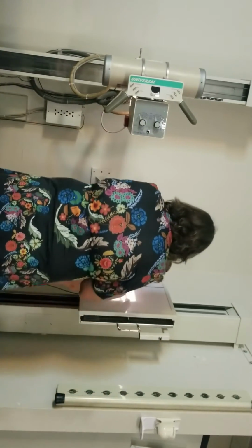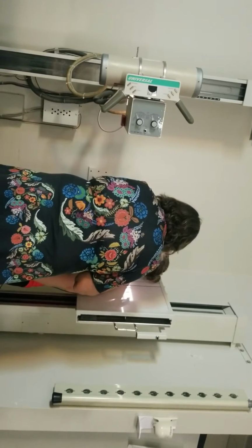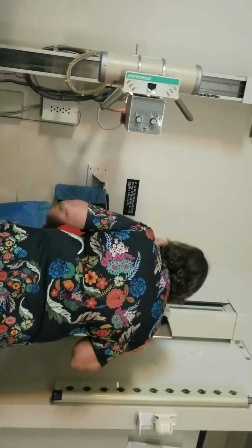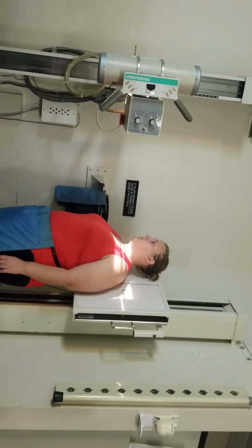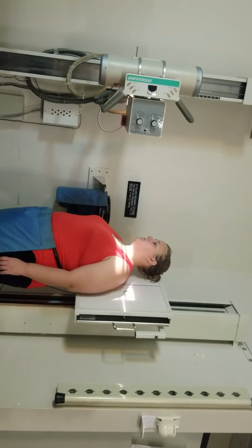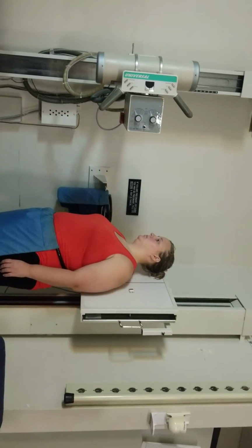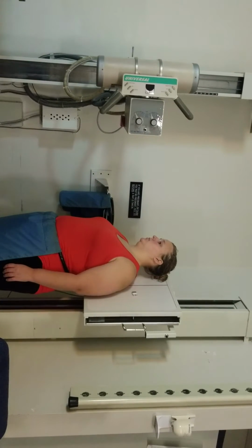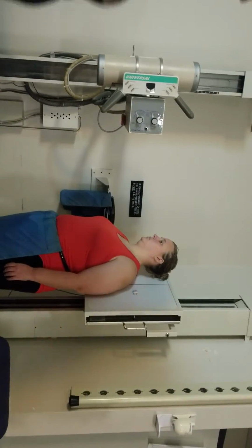I want to make sure I have both ends of the clavicle on. So I want to make sure that I have the SC joint, the AC joint on. I'm going to be centered to my film. I'm going to go back to that 10 mass that I used before. And Ellen, I'm just going to have you hold your breath. Don't breathe. You can breathe. Did I worry about where her hand was? This one is a neutral rotation hand again, so I'm not worried about how the humeral head looks.